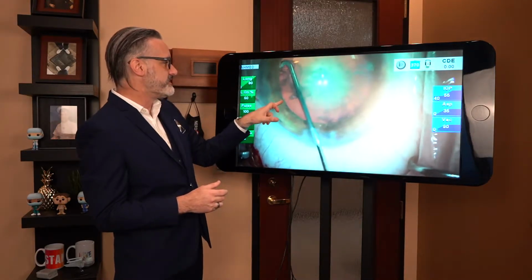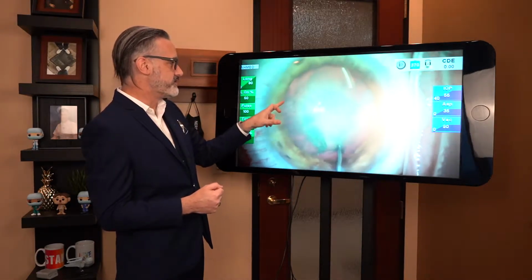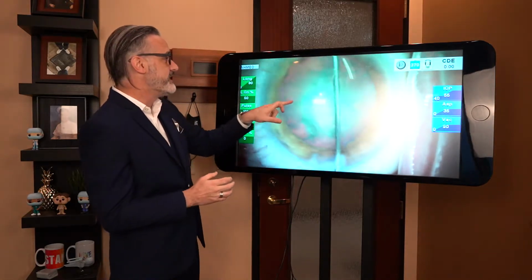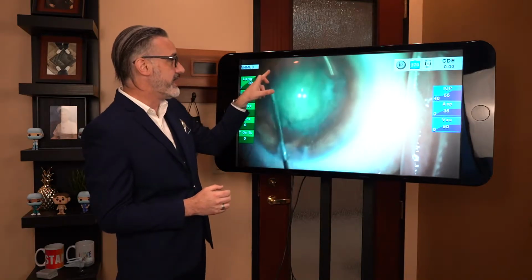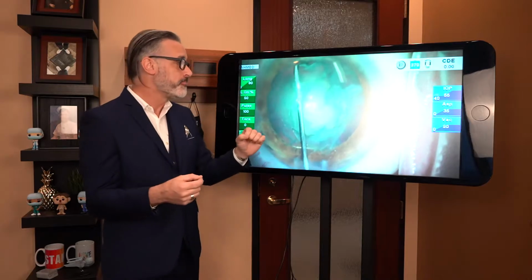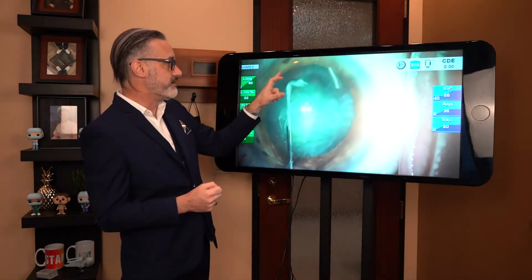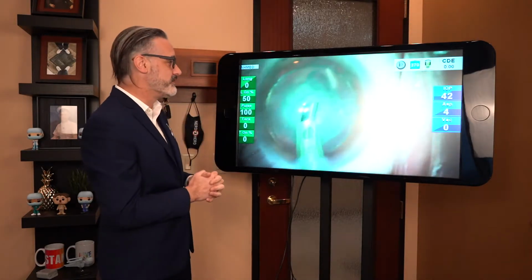And then they take a different tool, and now they're scraping away the sides. So this center part above the cataract, a little bit of margins was already removed. And now the doctor, with a nice little hook there, is going through and removing the outside. So think of it as like the pie crust, if you will. So the doctor removed the pie in the middle first, and is now getting the outside around it there, the crust, the round part on it.